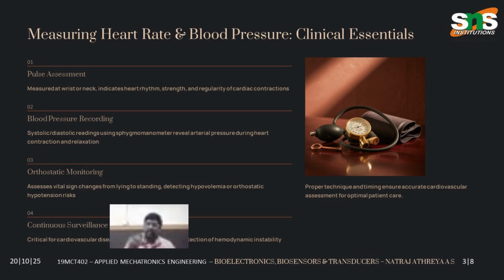The value will be denoted by the rise of the mercury in the manometer or the thin tube. It will help us identify what value it is at, and also at what point in time we can measure the systolic and diastolic readings. We can identify both these sounds and then identify the particular reading at that particular point in time.